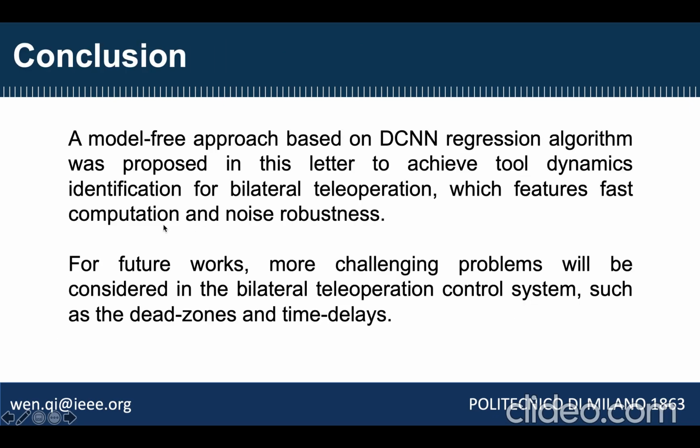Our study aims to develop a model-free approach based on DCNN regression algorithms for achieving dynamic identification for bilateral teleoperation, which features fast computation and noise robustness. For further work, more challenging problems will be considered in the bilateral teleoperation control system, such as the dead zone and time delays. The system tracking accuracy and stability might not be secured under these conditions, which remain the main preconditions for the success of the surgical procedure.